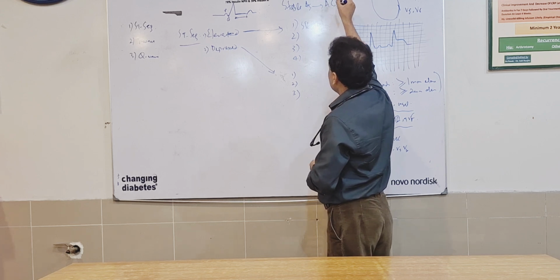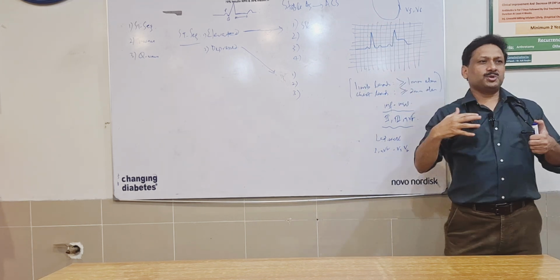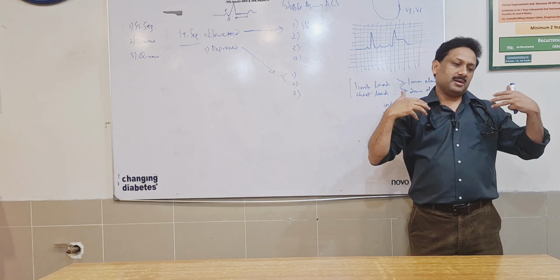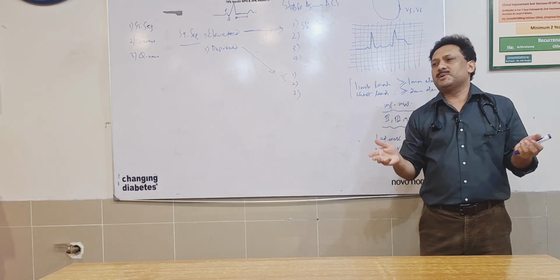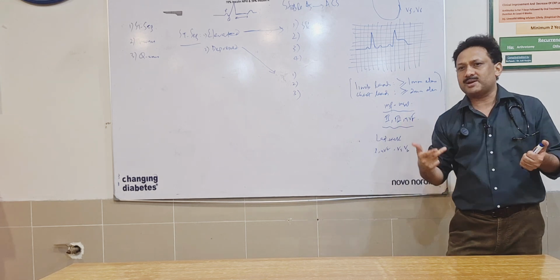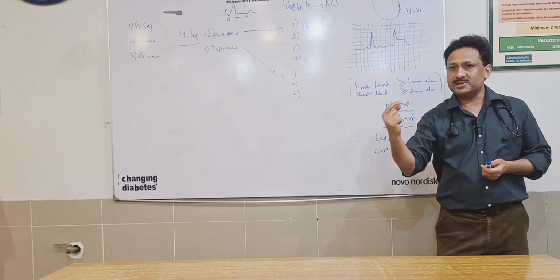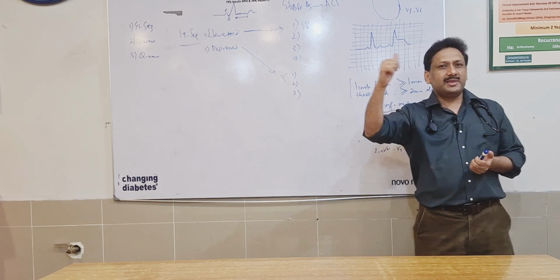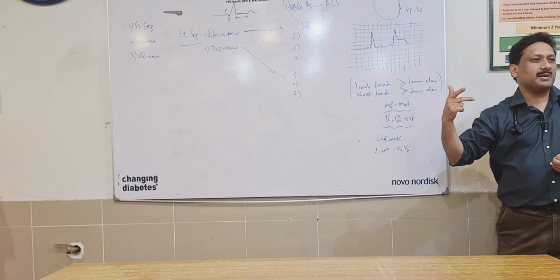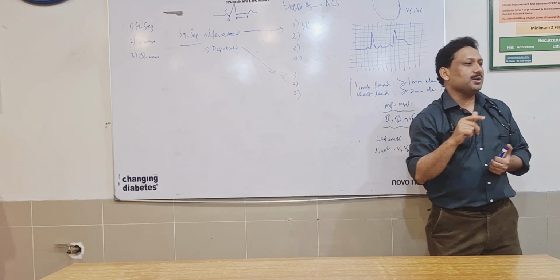And when you talk about ACS, how to proceed ahead, it's very simple. A person comes to you, you get his ECG done, that is the first thing. After symptoms which suggest that probably this person is suffering from MI, and usually in the presence of a lot of those risk factors, the first thing you always get is an ECG. And in the ECG, if you find that elevation which we are discussing, we'll label it as ST elevation MI. But then there can be 2 situations. You're not finding elevation there. What will you do next?